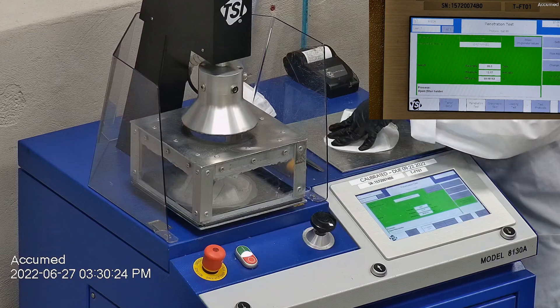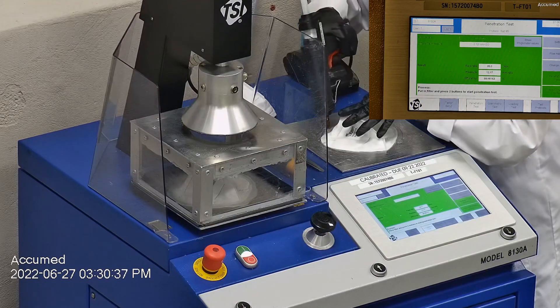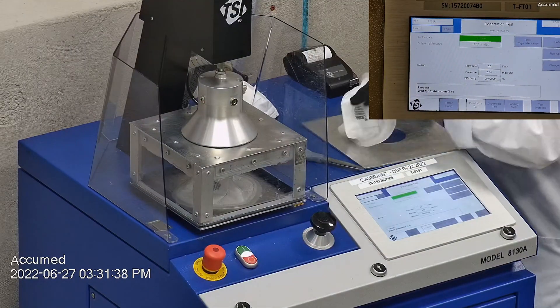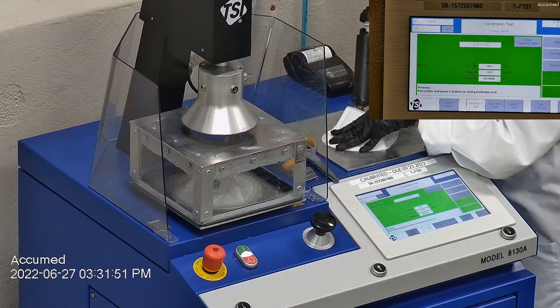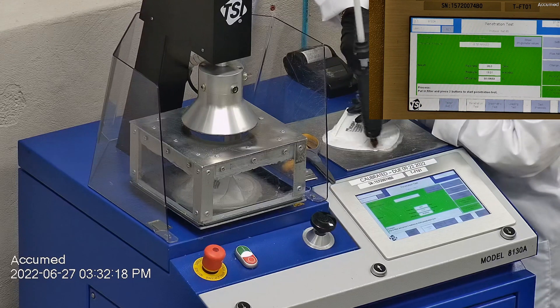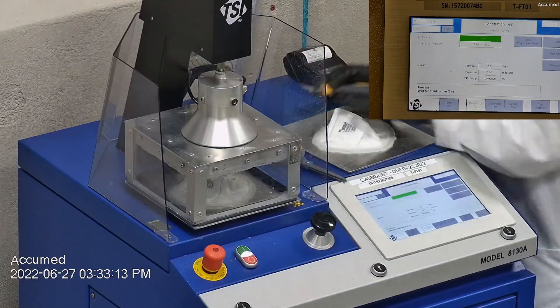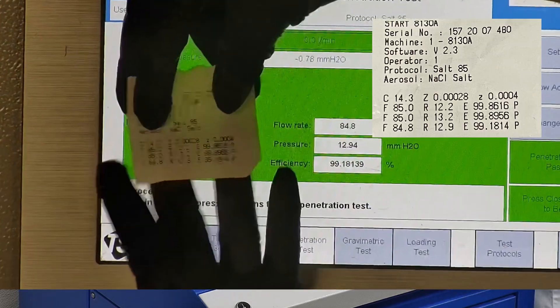The first sample tested at 99.86% filtration efficiency with a pressure drop of 12.2 millimeters of water. The second sample had a filtration percentage of 99.89% and a pressure drop of 13.2 millimeters of water. The third sample had a filtration percentage of 99.18% and a pressure drop of 12.9 millimeters of water.